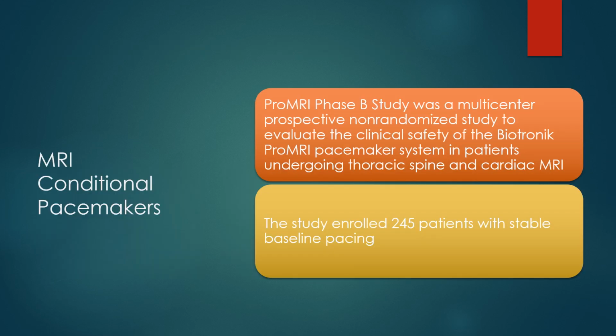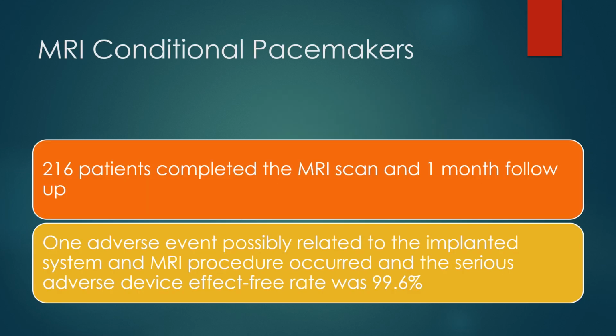Pro-MRI Phase B study was a multi-center prospective non-randomized study to evaluate the clinical safety of the Biotronik Pro-MRI pacemaker system in patients undergoing thoracic spine and cardiac MRI. The study enrolled 245 patients with stable baseline pacing. 216 patients completed the MRI scan and 1 month follow-up.